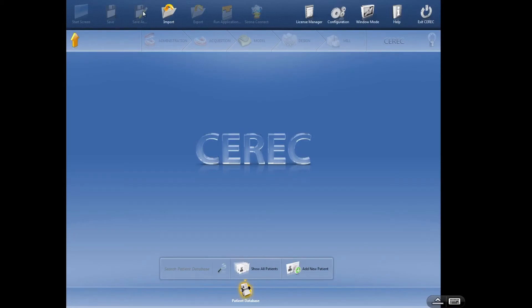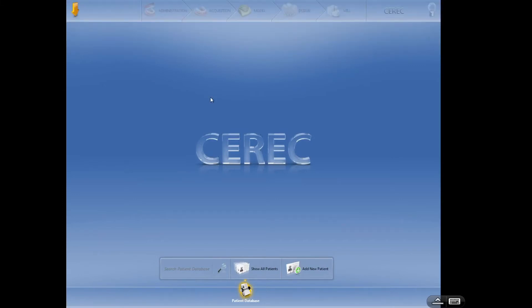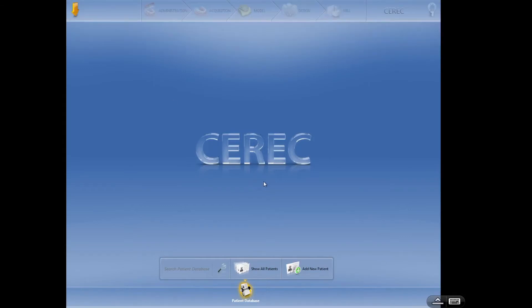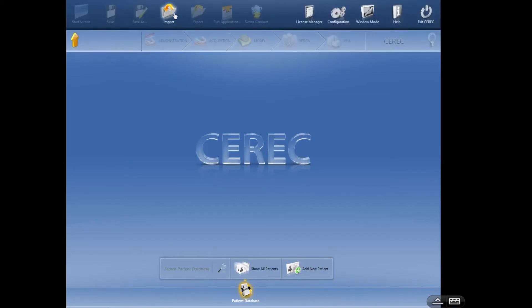Save As is self-explanatory — if you want to save the case under a different name, you can certainly do that and change some of the settings. Import: if I've got a case from another CEREC machine, or someone has emailed it to me and I've downloaded it, I can use this import. I can also, if I have it on the desktop or on a thumb drive, just double-click on it and it will automatically open the software. That's what the import is for.